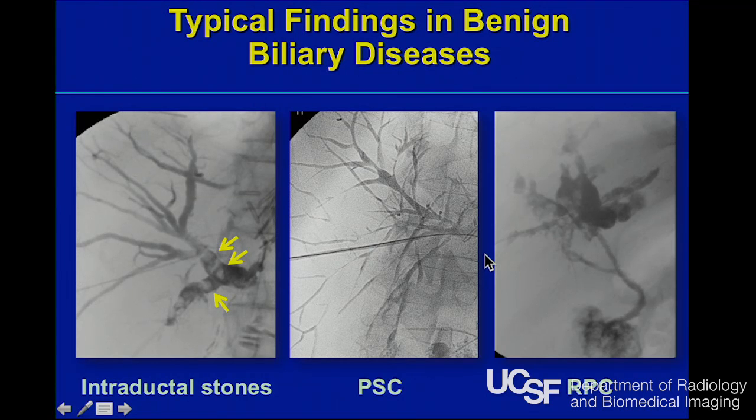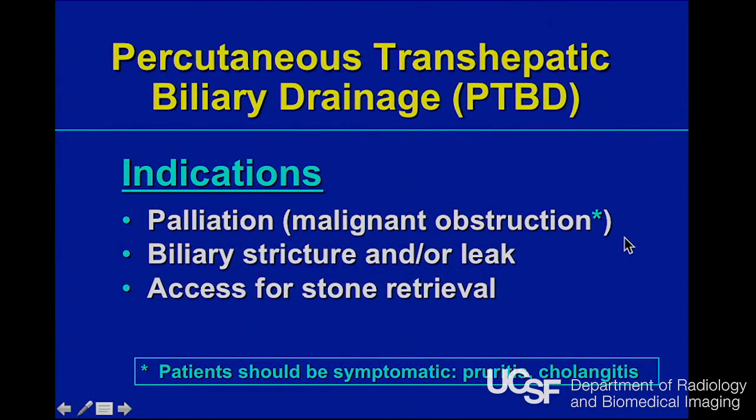And then this was a young patient who had recurrent pyogenic cholangitis. You see the ducts are extraordinarily bizarre. They're incredibly irregular. They're very dilated. There's areas of narrowing as well. There is a huge amount of debris in these ducts, and so this is a typical appearance of recurrent pyogenic cholangitis. Some of the diagnoses you can make.